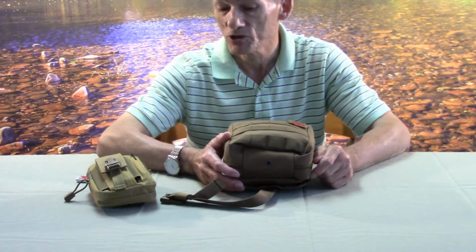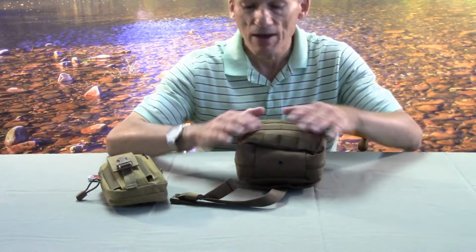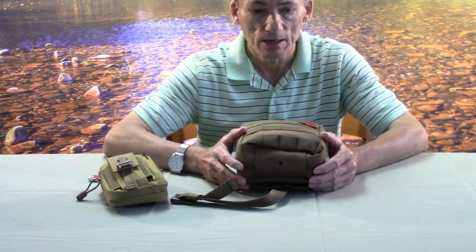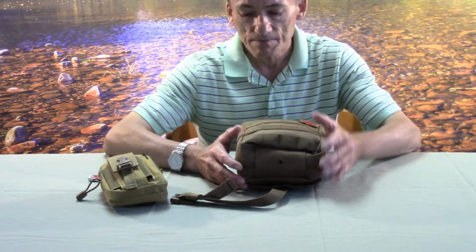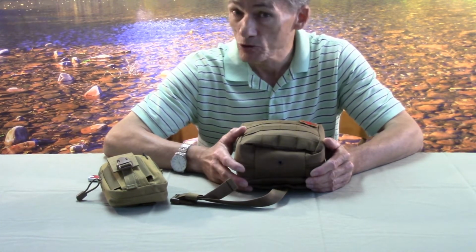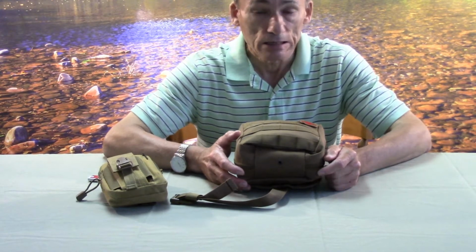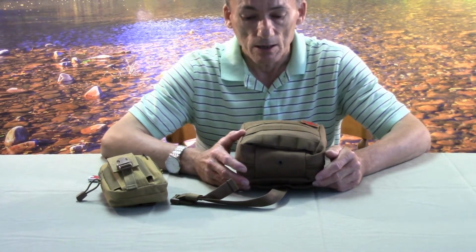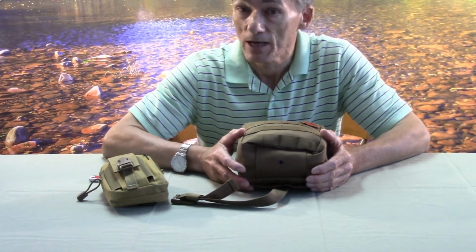an IFAK pouch. Essentially an IFAK kit differs from a first aid kit in that this is geared more towards being able to handle more traumatic types of injuries. It could be severe lacerations, gunshot wounds even. And I've included some things in here which can handle some of that.